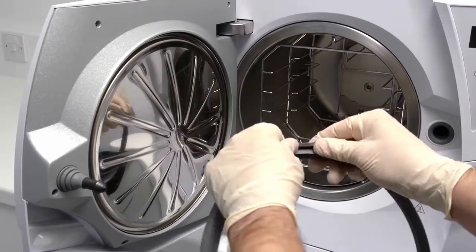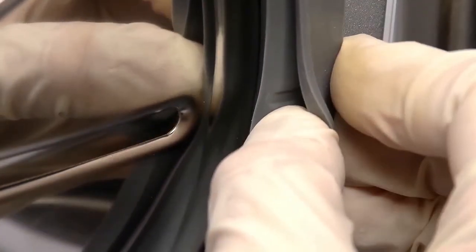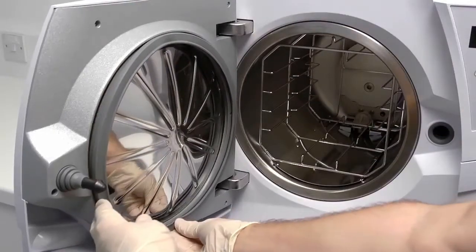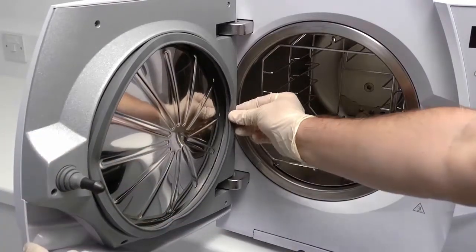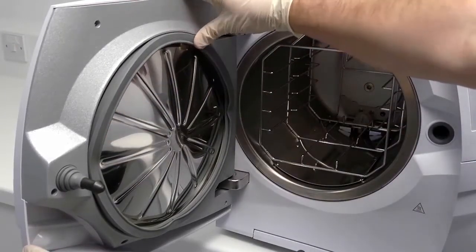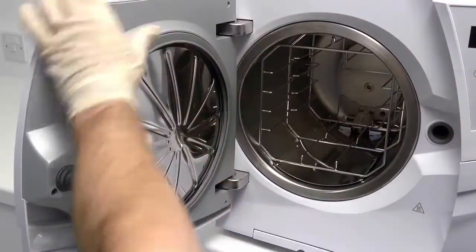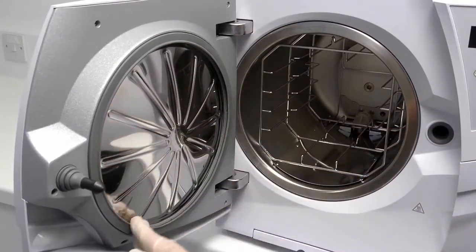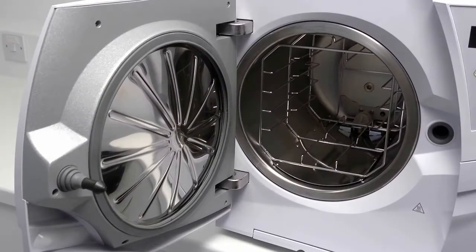The markings on the door seal can be matched up with those found on the porthole to aid fitment. Start by pressing the door seal into the seat at the top and bottom, then left and right. The remaining areas of the door seal can now be pressed evenly into place over its entire circumference. It is important to make sure that there are no bumps or deformations when the door seal is fitted.